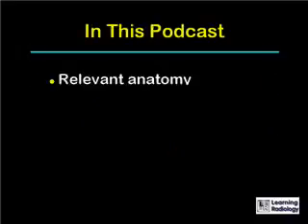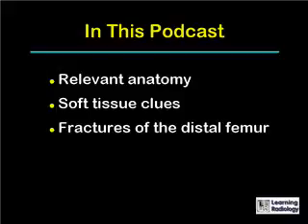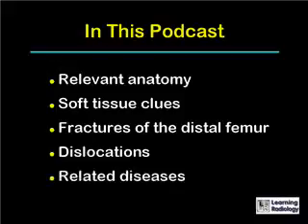In this podcast, we're going to discuss the relevant anatomy of the knee, some soft tissue clues that we can see on conventional radiographs, fractures of the distal femur, dislocations around the knee, and some related diseases.